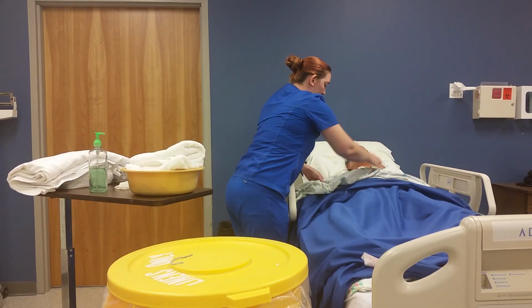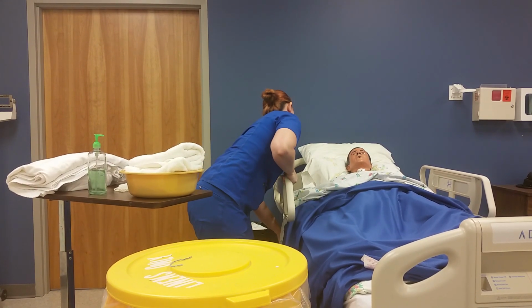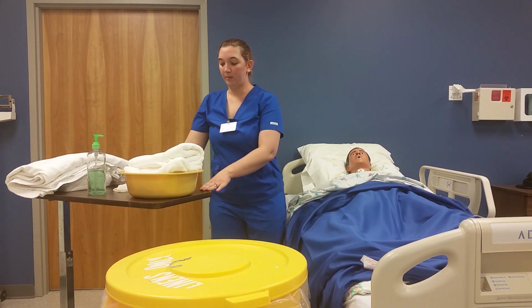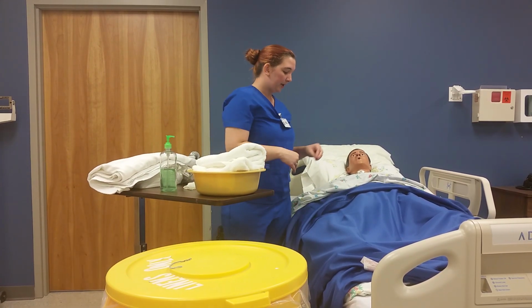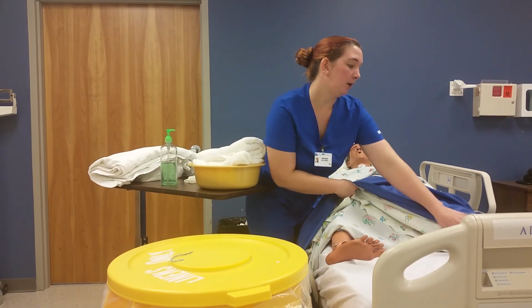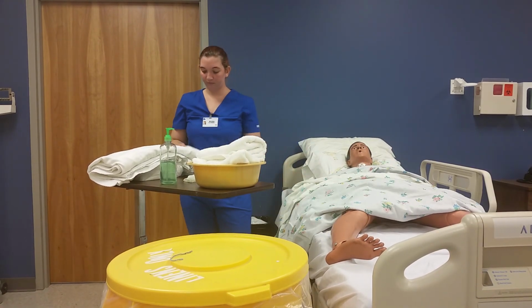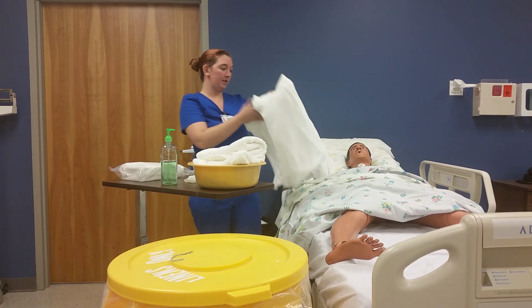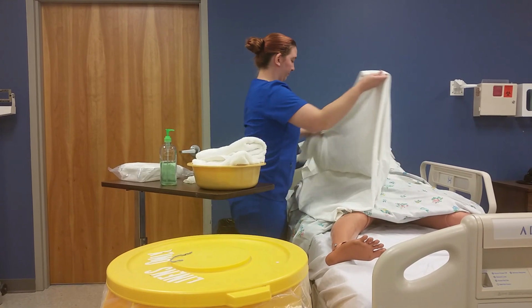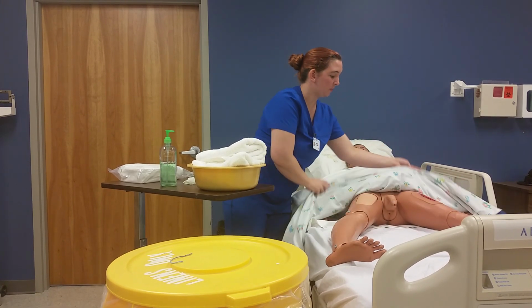I'm going to pull his blankets back. I'm going to lower this bed rail here. I've gathered all my equipment already. We're going to be doing some pericare before we place the catheter in place. Since his curtain's already closed, I'm going to pull this back a little bit. I'm going to place his bath blanket on. I'm going to pull this up just a little bit more.